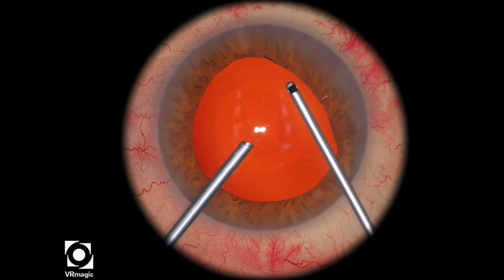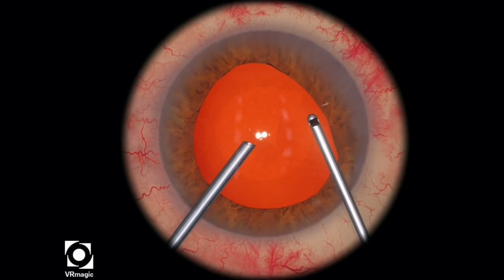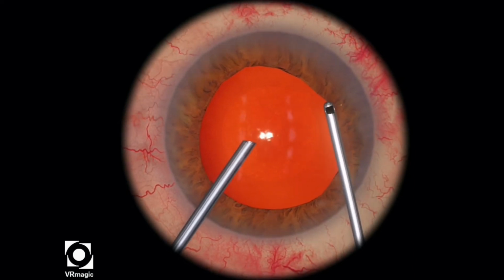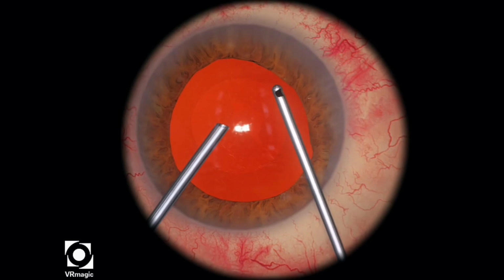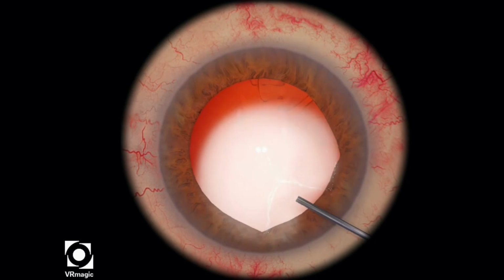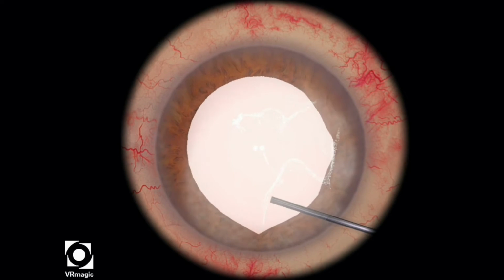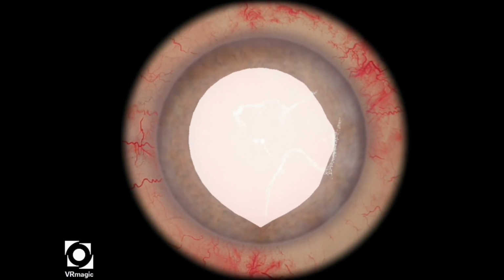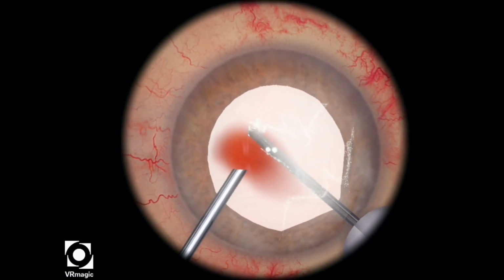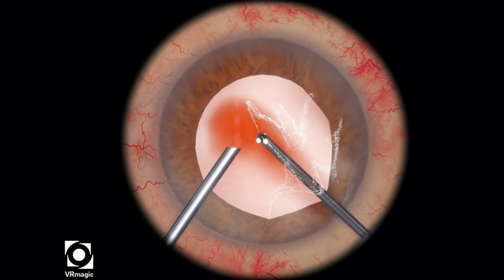And then the ones there near the side, I have to be very careful, and I almost have to angle it right above the iris, so my vitrector is pushing the iris down, and I'm turning my cutter opening or mouth towards that area. So that's how I completed that level there. Let's take a look at that one more time. So I stain it with Triamcinolone. I start at the bottom, right behind or below the posterior capsular rupture, and then I start cutting immediately.